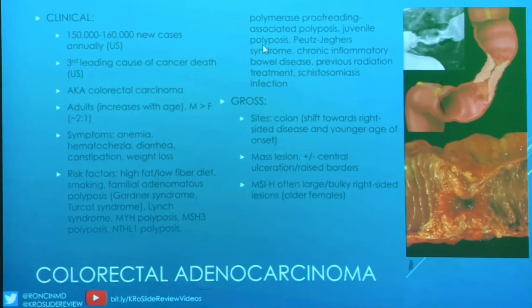These are mass lesions that may or may not have central ulceration as well as raised borders, as you can see on the top right. I have a beautiful schematic from ExpertPath. As you know, I absolutely love their pictures.